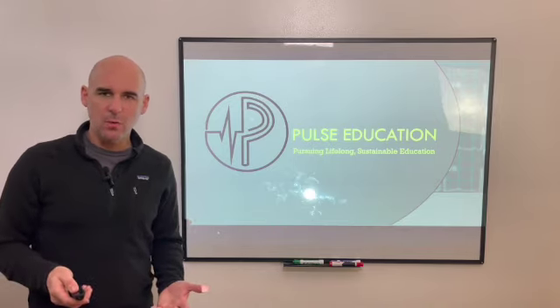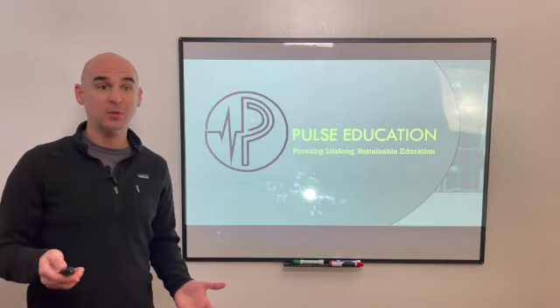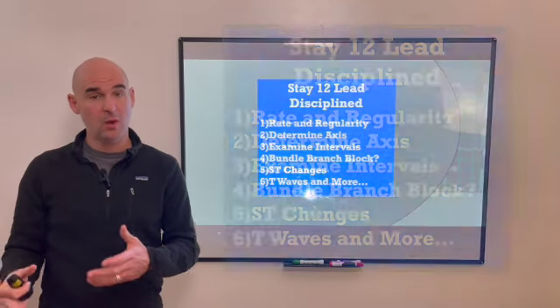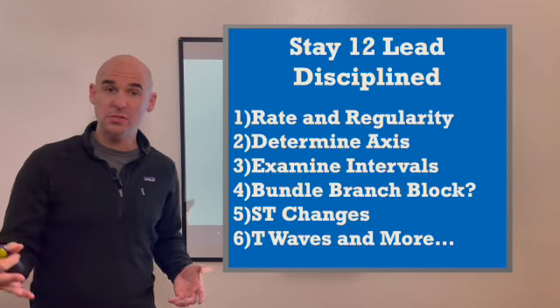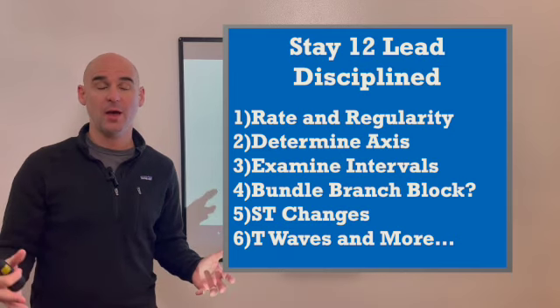In last week's video, we talked about and really stressed the importance of having a disciplined approach to 12-lead interpretation. In doing so, we're not going to miss anything. And if we miss something, we could potentially misdiagnose, underdiagnose, or overdiagnose our patient. And we don't want to do that. We want to be right.